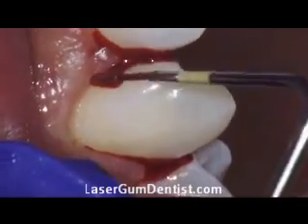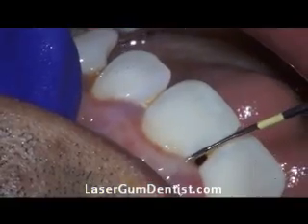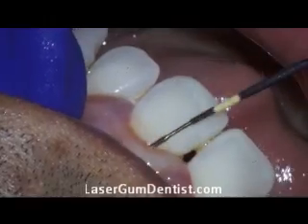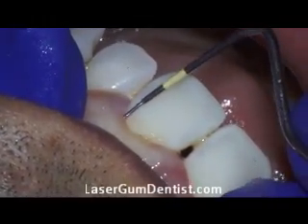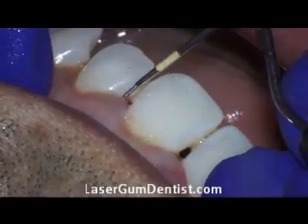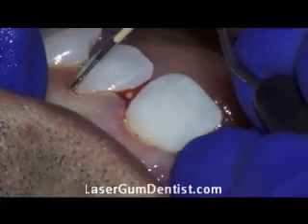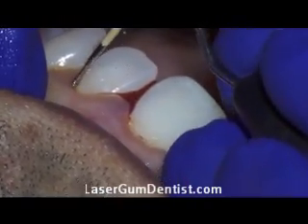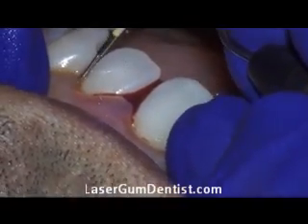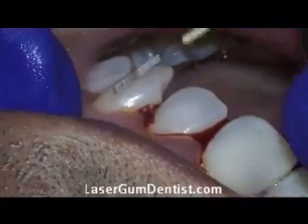We did a procedure called LANAP — Laser Assisted New Attachment Procedure. The 'new' part is not that it's a new procedure; it's been in the literature over 20 years, in a specialty recognized by the American Dental Association. So it's not a new procedure, but what we're talking about with 'new' is that we're getting new attachment.